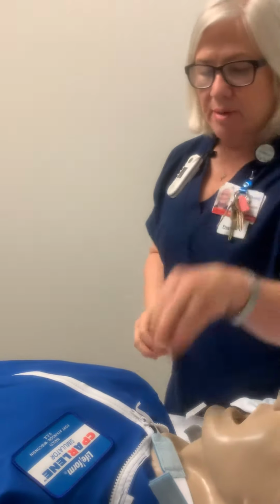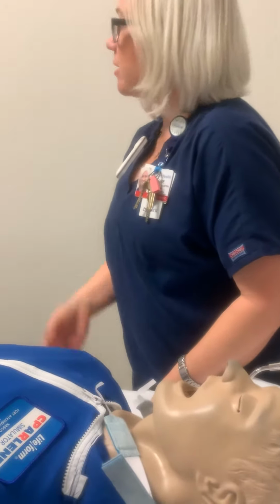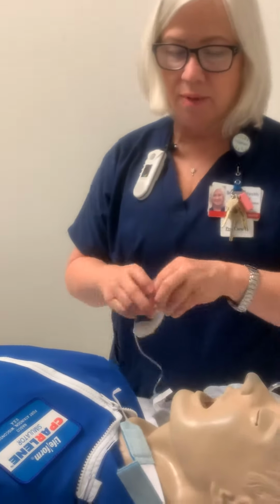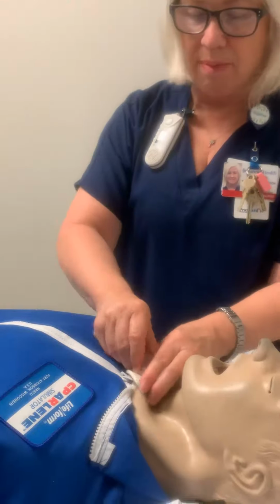So, I'm gonna ventilate here. Why? Because I don't have an upper airway. It's gone. My larynx is completely gone. And of course, they can't talk to you because their vocal cords are in their larynx. But you should always know what kind of an airway you're dealing with here. That's why we call this the Altered Airway Initiative, real big here at Banner.